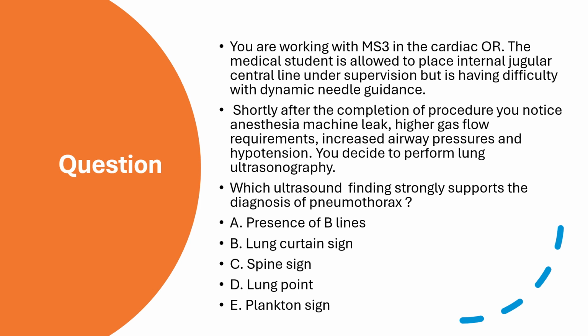A. Presence of B lines, B. Lung curtain sign, C. Spine sign, D. Lung point, and E. Plankton sign. Please pause the video if you need more time to answer the question. And the correct answer here is D. Lung point.